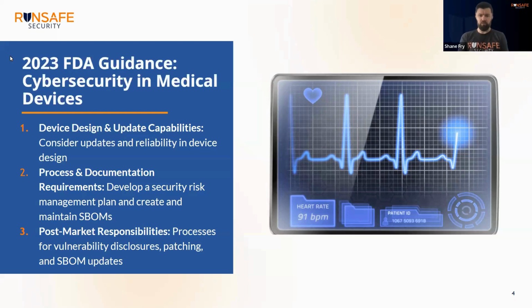But when we talk to device manufacturers that are using it, they're spending a lot of man hours hiring engineers to triage bad SBOMs. And so that's where you really want to start shifting into build time SBOMs so that what you're getting as your software bill of materials is exactly what showed up in the device. And then once you have that, you can more easily understand the security risk posture that those devices have.